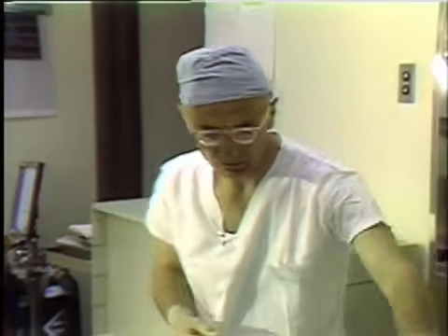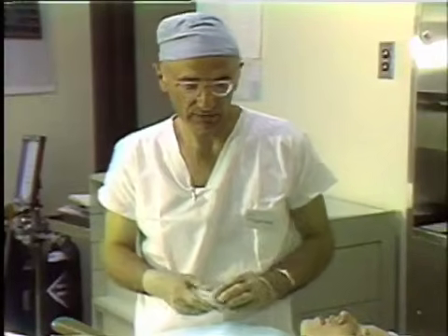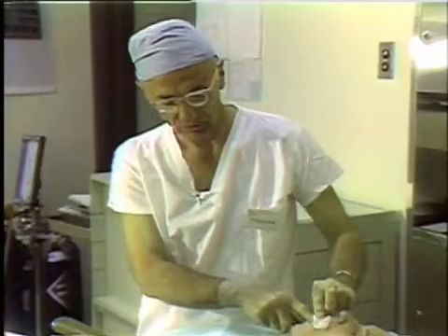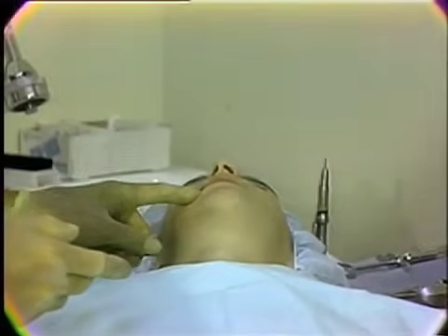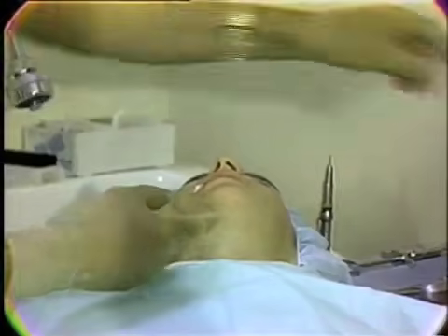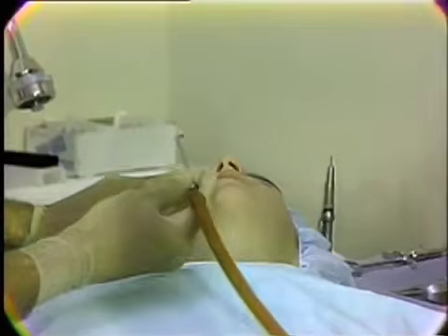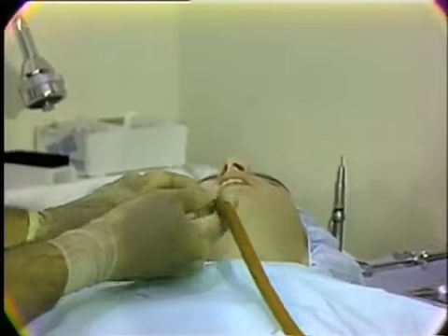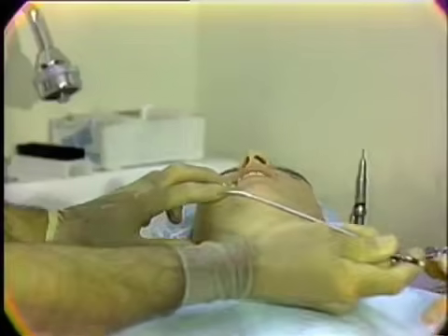As we were demonstrating earlier, if for any reason you leave the field, you always place a sponge over the operative field, have the patient close on it. Throughout the procedure for the division of tissue, removal of bone and teeth, we would use suction to keep the field clear. However, in the closures, we would use intermittent pressure with sponges in order to avoid that.